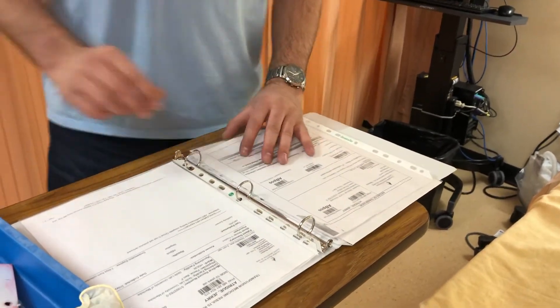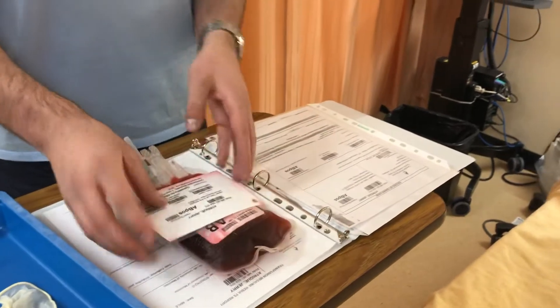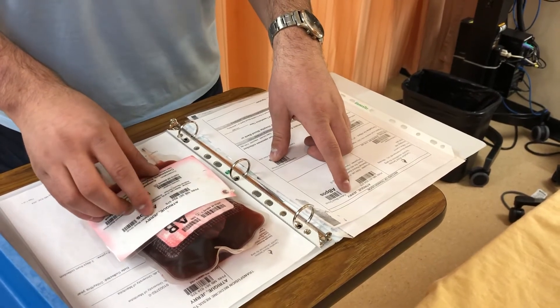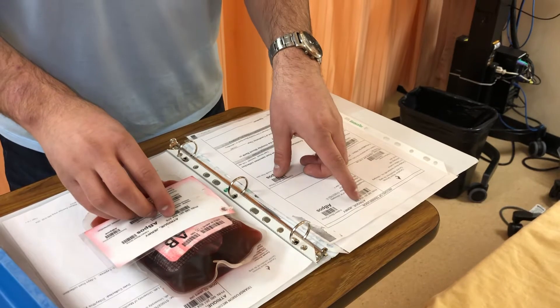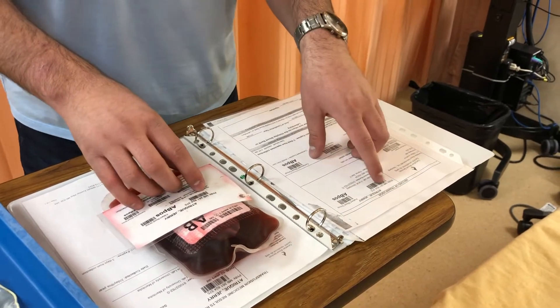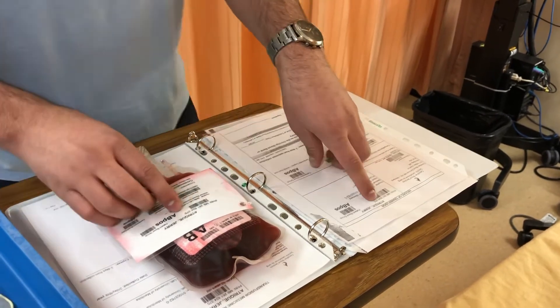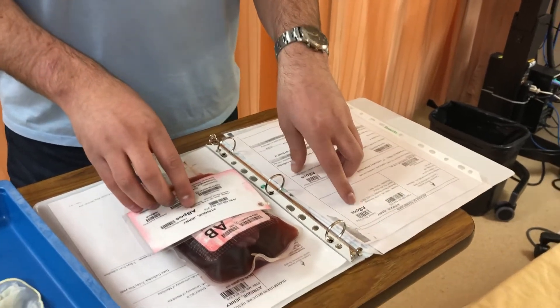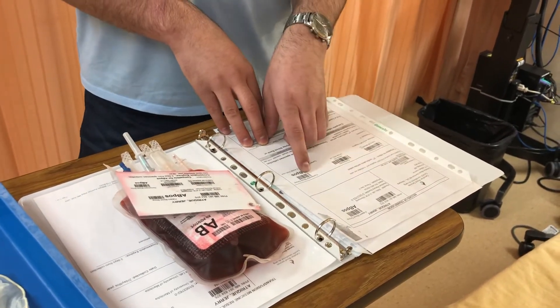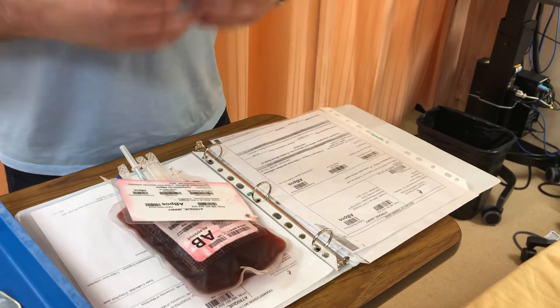Now I can take the record of transfusion and compare it to the blood tag. With my second nurse, we verify: Jerry — J-E-R-R-Y — Atrique — A-T-R-I-Q-U-E — FIN 261-824-375. The patient is AB positive — that's their blood group — and today on the unit we have AB positive blood. These two are compatible, so it's safe to give.